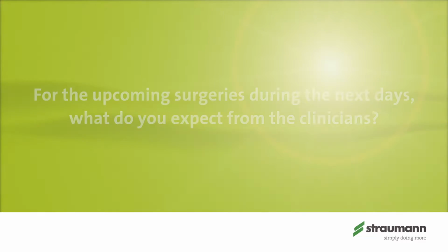Because with this type of patients, with the edentulous patients, the problem is always how to rigidly place the guide, which will not change position after delivery of the anesthetics, after a little bit of swelling of the soft tissue. So using these temporary implants as a support on the bone is really a great idea, I think.